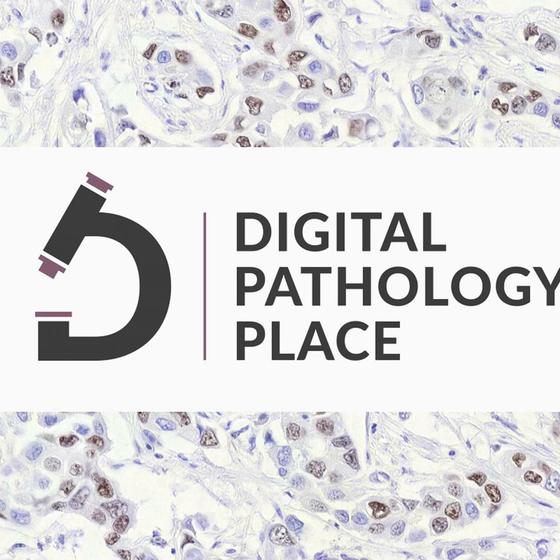So you can actually watch the movie by downloading it part by part, and at the end you've seen the entire movie. And luckily you don't have to download the entire movie before you can watch it, because that would be very annoying. And this is essentially the same trick applied to computational pathology. So the network actually sees the entire image, but it only sees it part by part. But at the end it has still seen the entire movie.